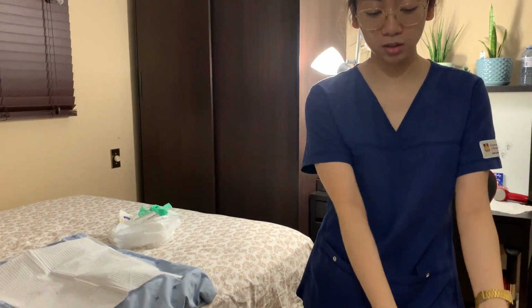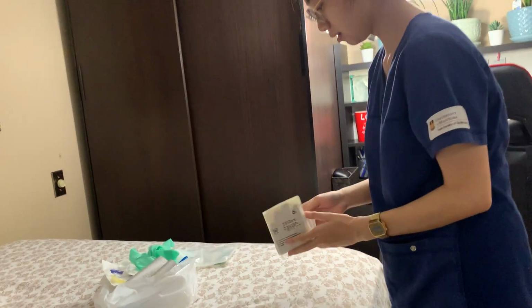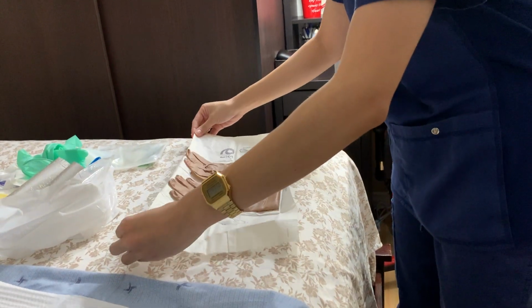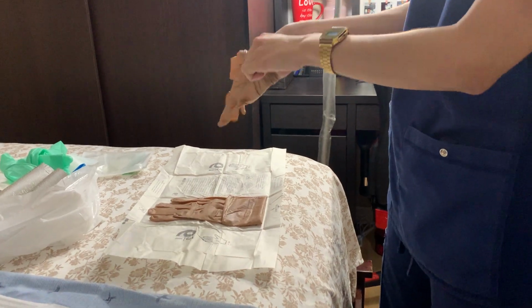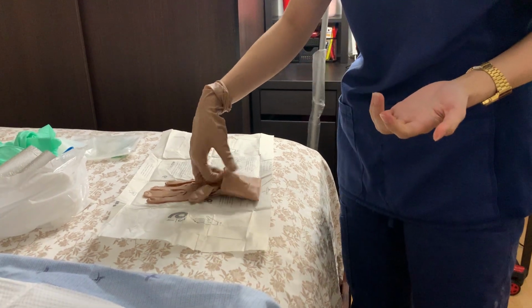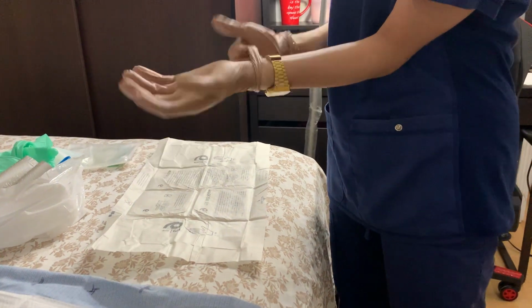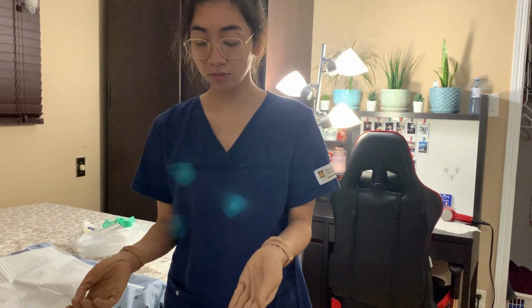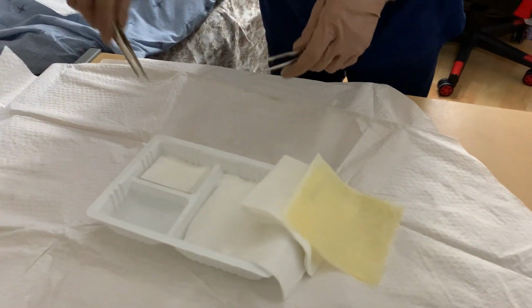I'm going to put on sterile gloves, and since I don't have any space here, I'm going to use my patient's bed to put on my sterile gloves. Okay. And now that I'm sterile, I can touch everything in my sterile field. So I'm just going to grab my forceps here. And I'm going to make a rosette now.